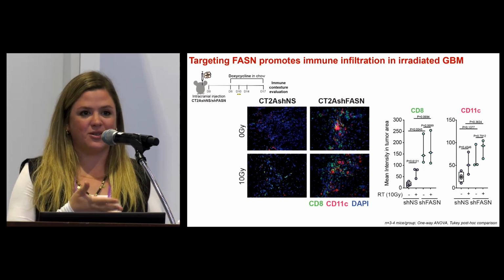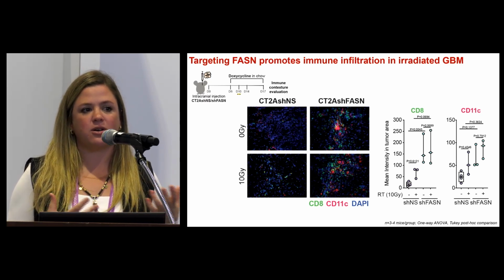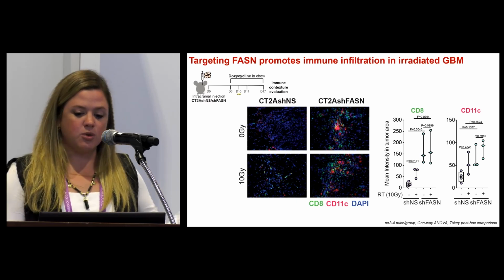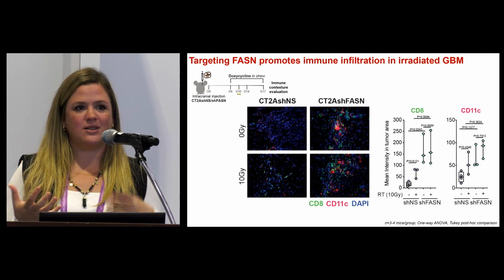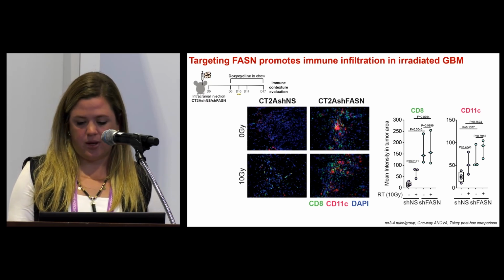But now, based on Canopy's results, we think that they might be macrophages expressing CD11C, or maybe microglia. In the brain we have these resident immune cells that can also present antigens and mount an anti-tumor immune response. So based on the findings that we got through Canopy, we are trying to validate this and expand this population of CD11C expressing myeloid cells in the brain.